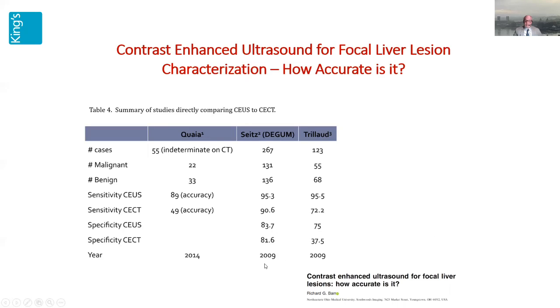And the technology associated with the use of contrast-enhanced ultrasound has, of course, improved dramatically over the last 10 or 12 years. So these figures will hold true, if not improve even further.